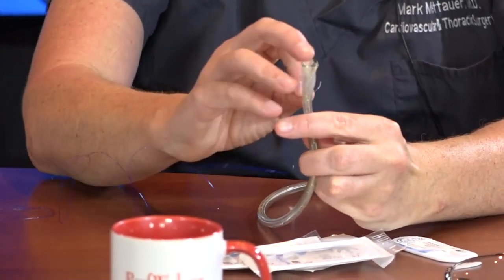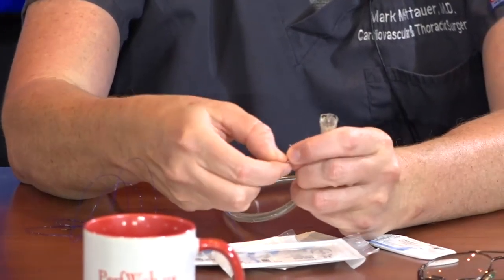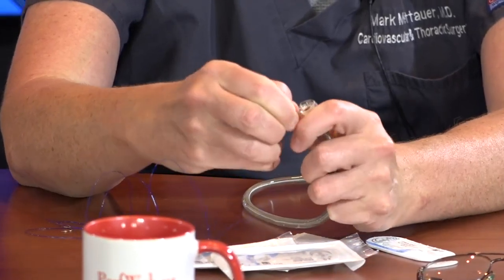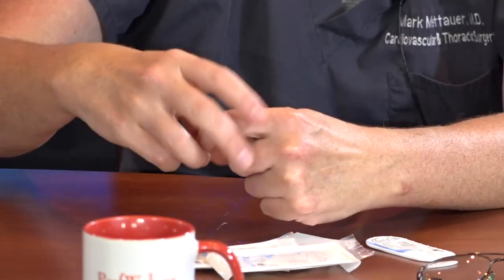And you can actually kind of rig this to be able to steer it into the pulmonary artery. Is there any way to zoom in on this? Okay. So, here's the tip. Here's the pedals that we're talking about and the little balloon inside. Where the black mark is, now you use a needle driver because it's easier, but you actually just put a stitch right through. It has to be a 48 inch, a long one, or a 36. 48's better.